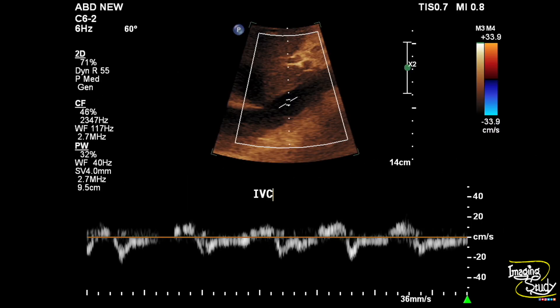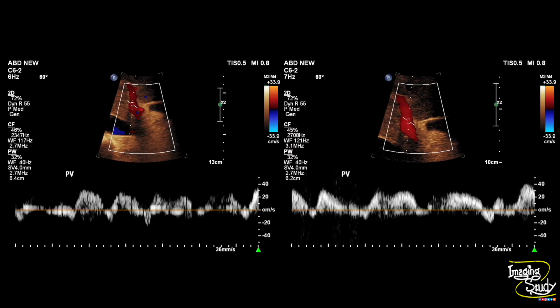Here is the flow pattern of the distal inferior vena cava, and you can also see the loss of regular triphasic W-shaped wave pattern due to increased right atrial pressure. Here is the portal vein, and you can see the increased pulsatility of the portal venous Doppler flow, which also indicates the abnormality at the right heart.